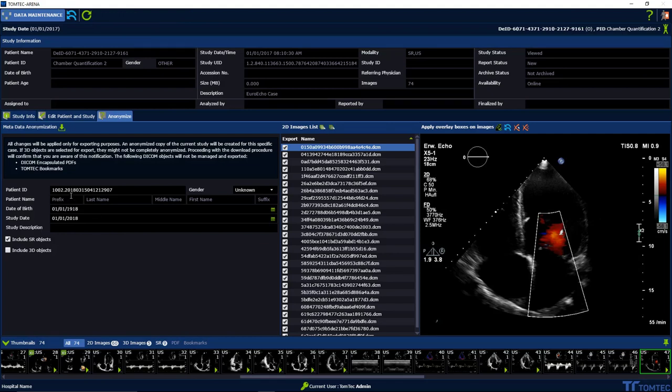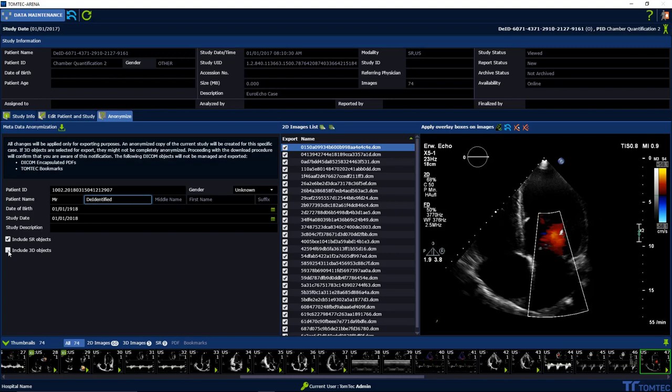Add a patient name like de-identified and study description. Include 3D objects to your anonymized export by activating the respective checkbox.